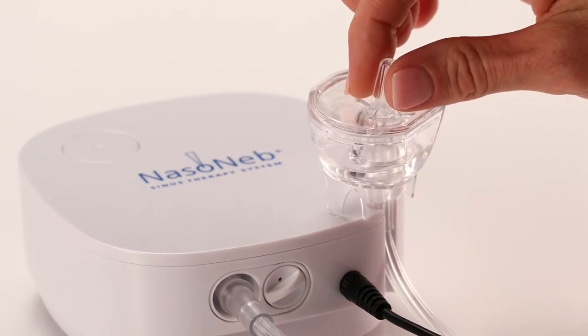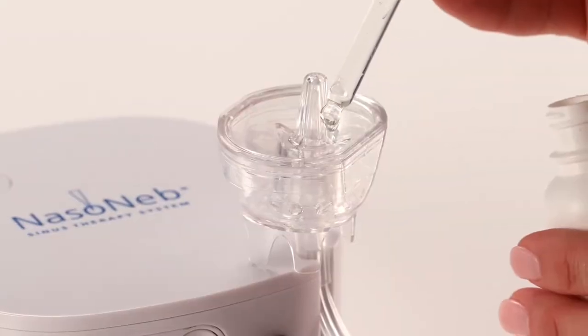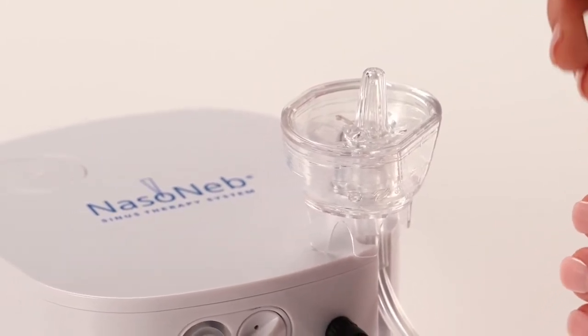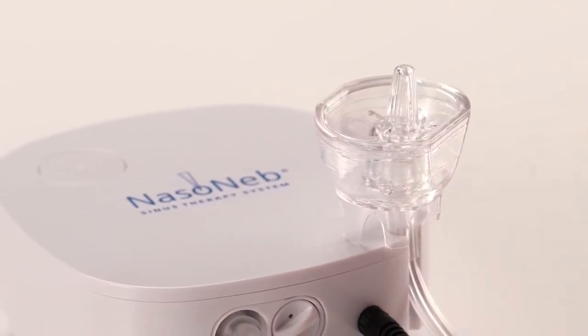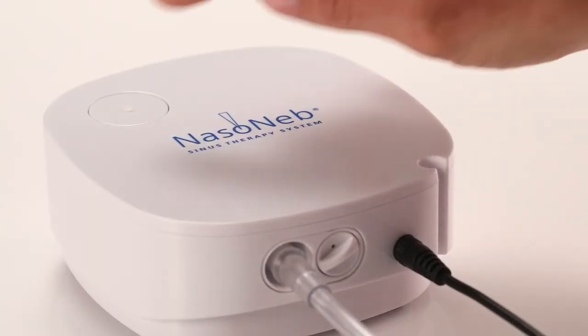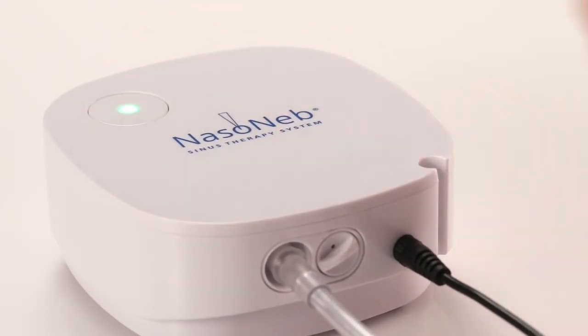Place the insert into the cup. You can also put the medicine into the cup after you place the insert by pouring the medicine in through the vents in the insert. Stand in front of the sink. Bend slightly at the waist and tilt your head down slightly about 30 degrees. Pick up the cup and place the nozzle into one nostril. Turn on the compressor. The system will propel the spray into your nose.